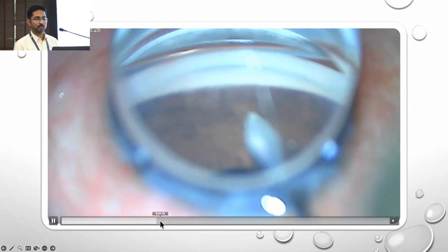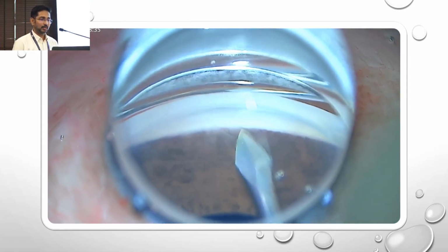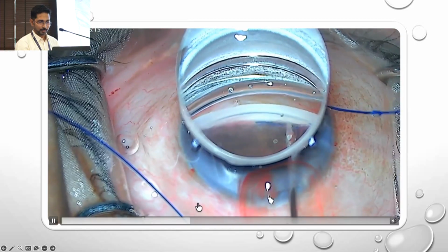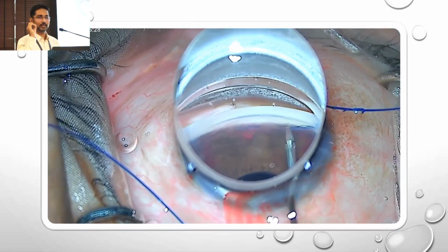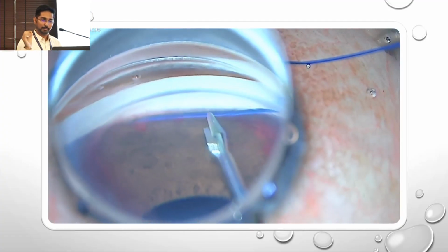Then once the suture is introduced, you visualize the angle and make a goniotomy. This is a well-made incisional goniotomy. You can see the posterior Schlemm's canal; the roof of the Schlemm's canal has been de-roofed. And then we pass the suture. Once the suture passes around 180 degrees, you will get a slight resistance. You have to overcome that resistance and keep passing it.